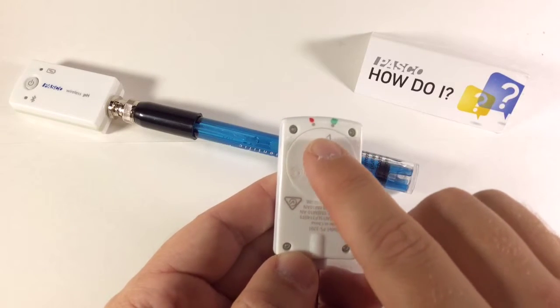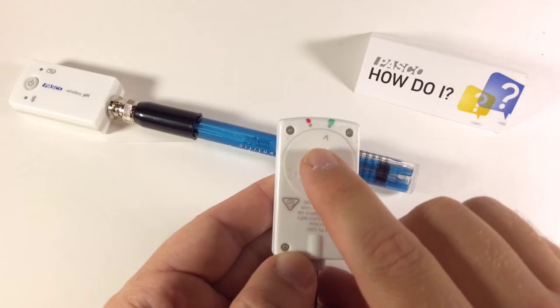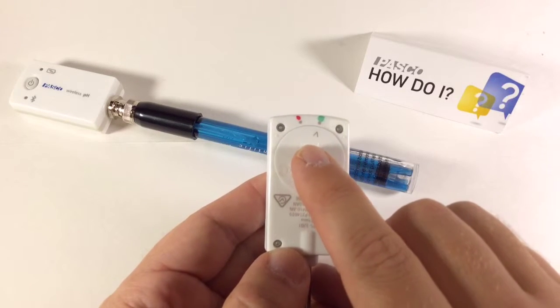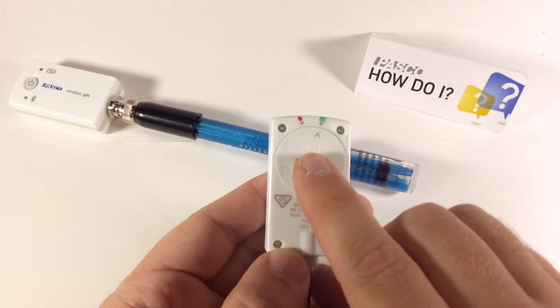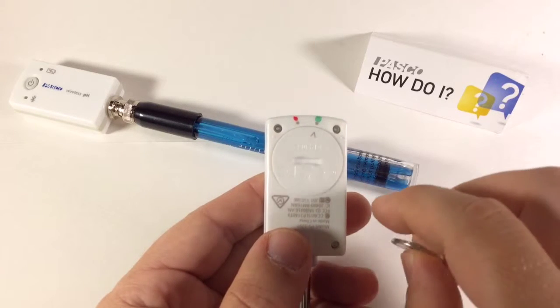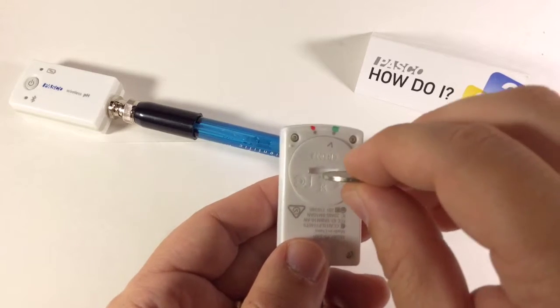There's an arrow that's pointing to one of two dots. I've marked my dots red and green, so you can see them a little more clearly. Currently, the arrow is pointing to the dot on the right, the green dot in this case, and that shows that the battery compartment is closed and sealed.